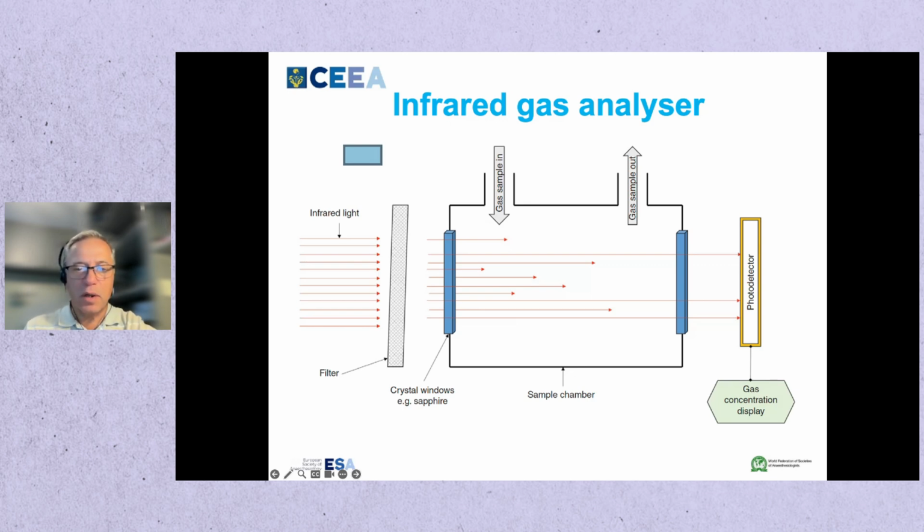This follows the Beer-Lambert law, which describes the relationship between concentration of the measured substance and the path length of infrared beam traveled.